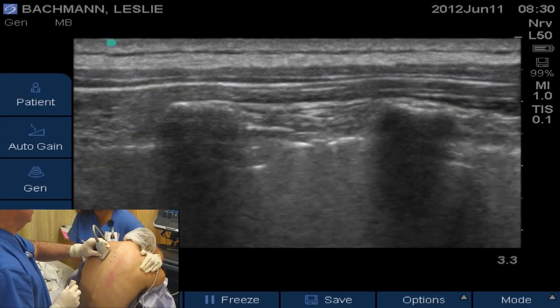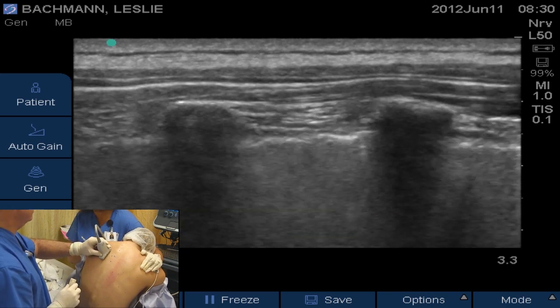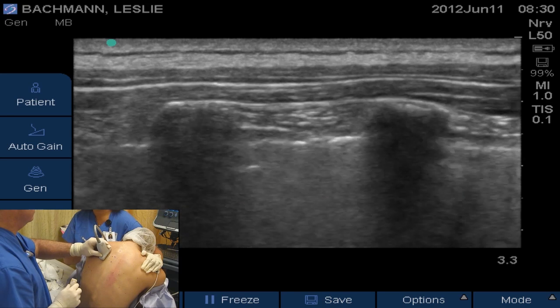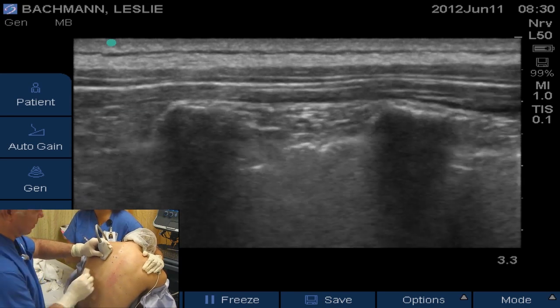And here's our image on ultrasound. You can see the T3 transverse process, the T4 transverse process, the pleura — the shiny pleura you can see very easily — and then the costal transverse ligament just above the pleura.